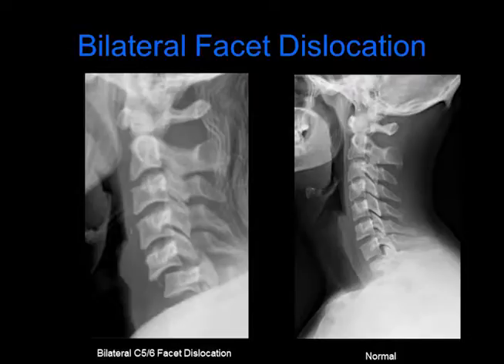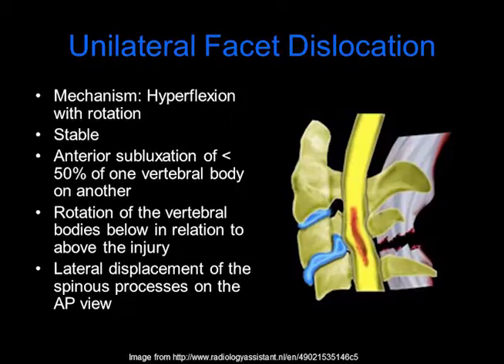On the right, we have a normal radiograph. You can also get a unilateral facet dislocation — the mechanism of this is hyperflexion with rotation. This is considered a stable injury. There is anterior subluxation of less than 50% of one vertebral body on another. You can see rotation of the vertebral bodies below in relation to above the injury, as well as lateral displacement of the spinous processes on the AP view.